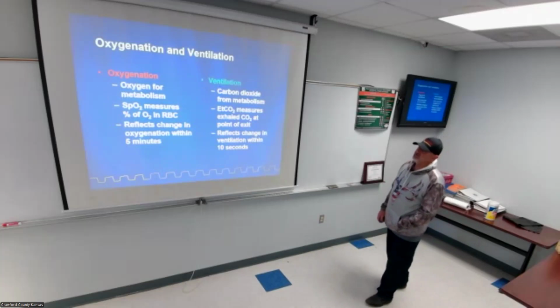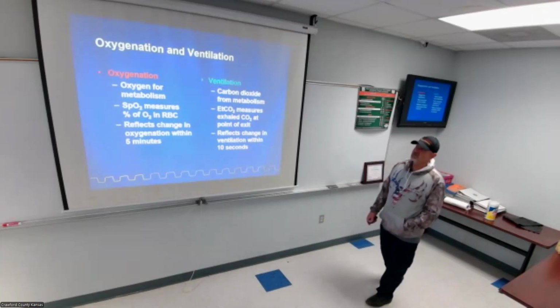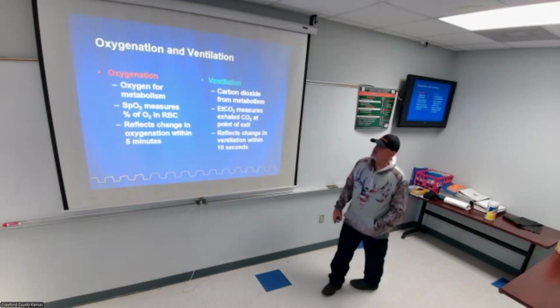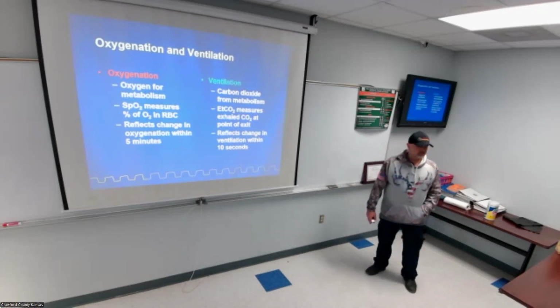Okay, so oxygenation. Oxygen for metabolism: SpO2 measures the percent of O2 in the red blood cell and reflects changes within 5 minutes. Ventilation: end-tidal CO2 measures exhaled air and reflects changes within 10 seconds.